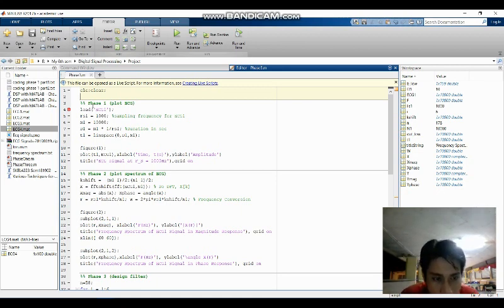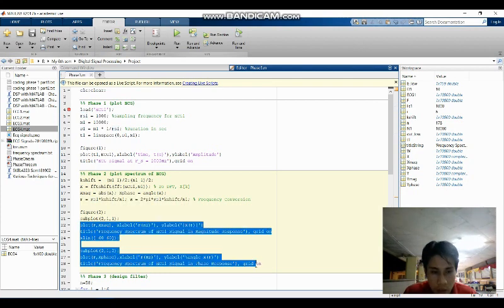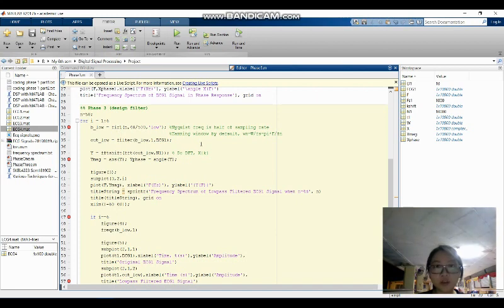So, here we have the code from phase 1, where it will load the ECG1 and we define the sampling frequency, the sample size and the time domain, and we plot it using this command to obtain the magnitude and phase spectrum. So we use this code from phase 2. We use the discrete Fourier transform where we use the K domain here, and we transform it to the Fourier transform using the K to F domain equation, and we plot it using this code. Now I'm going to explain the MATLAB code for filter design.